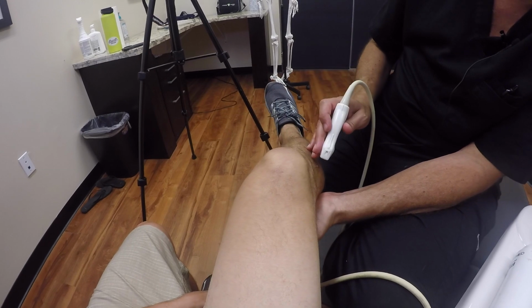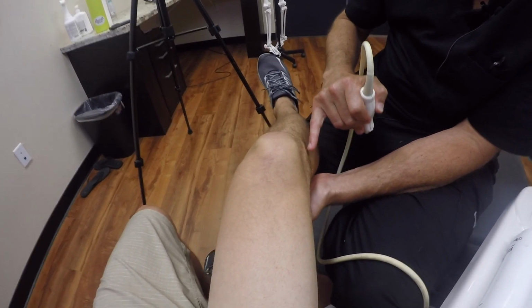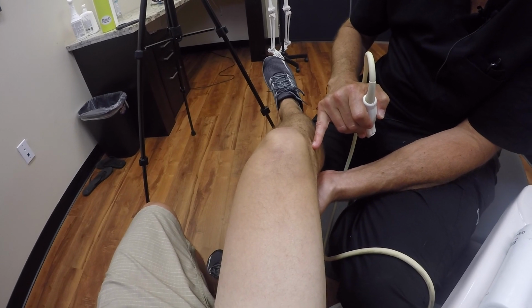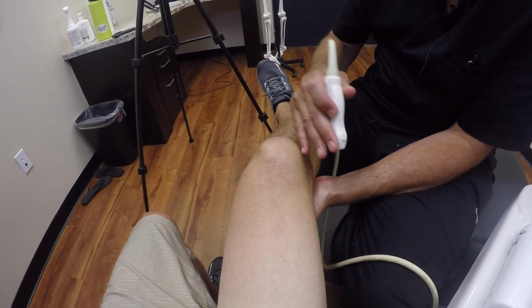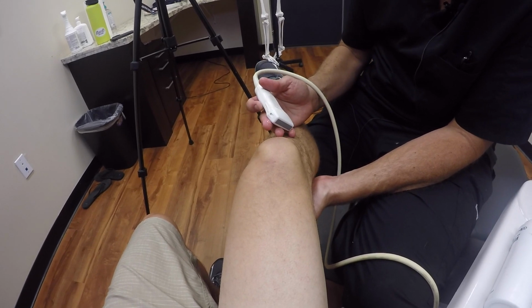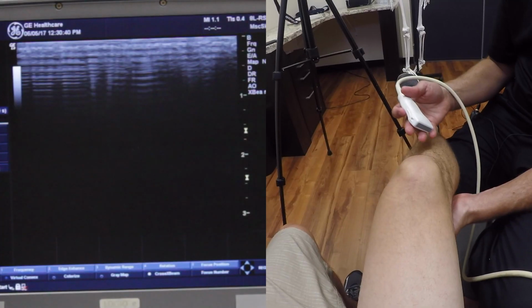So right away we could see in your knee that the only thing abnormal is a little bone spur that we believe is there. We'll have to get an x-ray. This would be a great thing to get an x-ray and confirm it. I don't think so far there's an MRI needed for this knee. There's nothing that we've come across that's out of our grasp at this point.